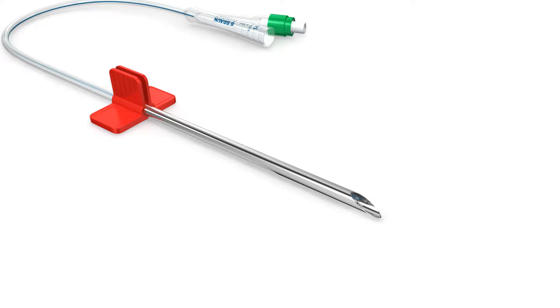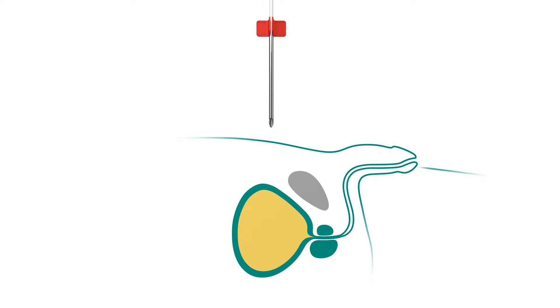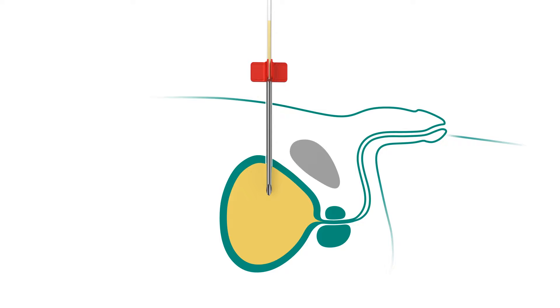If the catheter is advanced beyond the puncture cannula bevel, there is a risk of damaging the catheter. Insert the metallic cannula through the skin and advance under gentle pressure together with the catheter into the bladder. A flow of urine is observed through the catheter's tube.